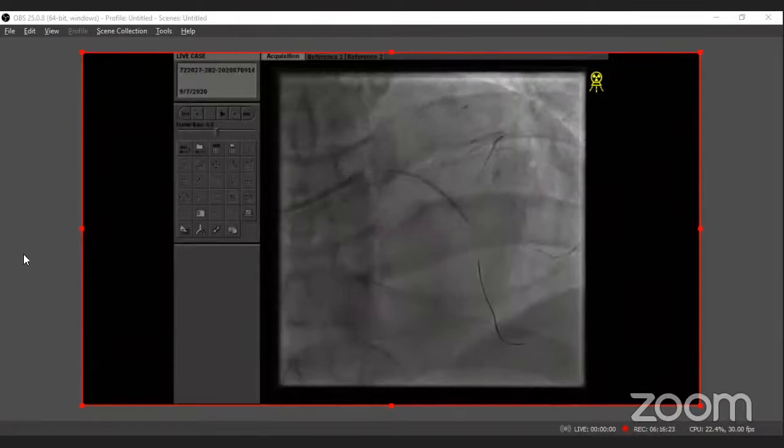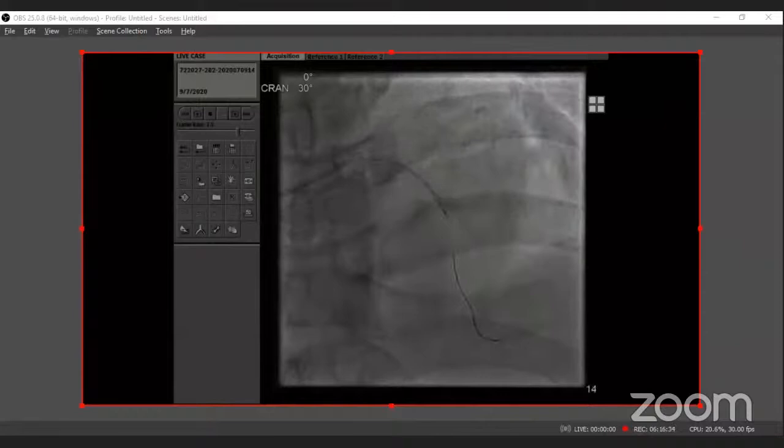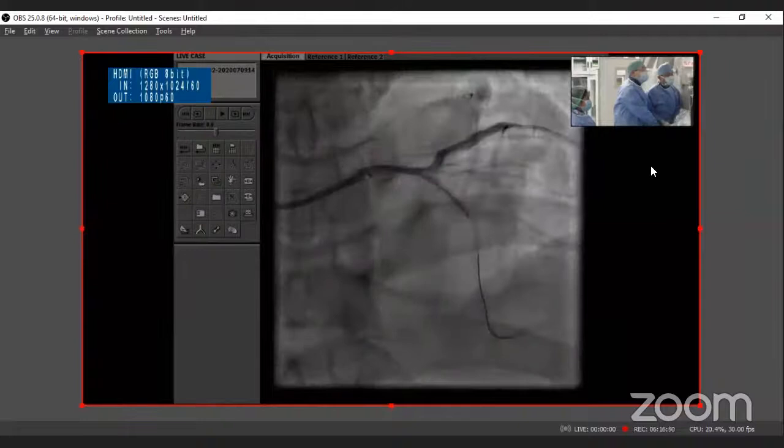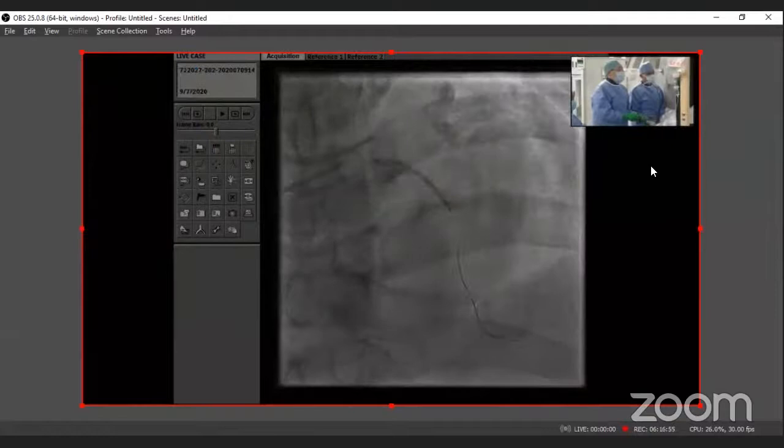Back a little bit. Test. Back a bit more. Back more. Okay, yeah. Maybe too far back, I think. Maybe you can go in a little bit, just before the bifurcation. Okay, yeah, nice. Go. Inflating. Nominal. 9, 10, yeah. Expanded nicely here.